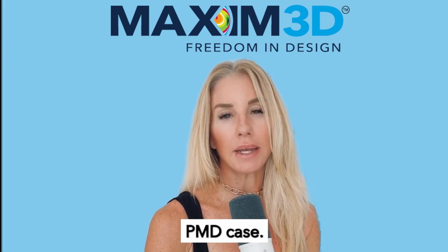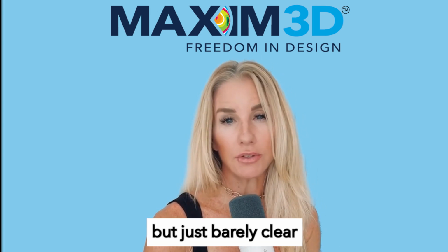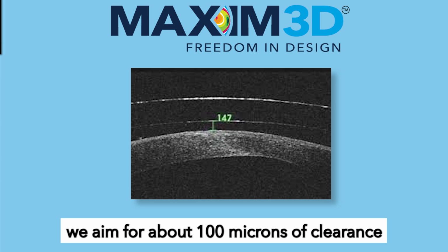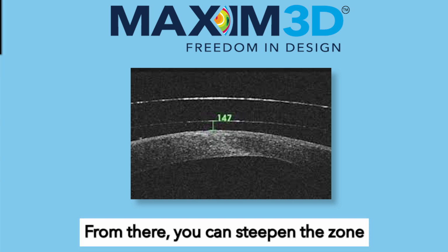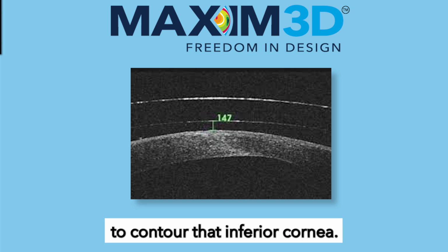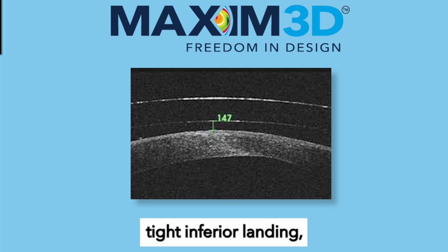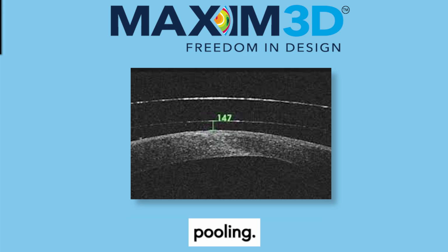Take a classic PMD case. You might see excessive vault at the top of the optic zone, but just barely clear the cornea at the bottom. Since the optic zone must remain spherical for vision quality, we aim for about 100 microns of clearance over the closest point. From there, you can steepen the zone directly below the optic to contour that inferior cornea. Then recontour outward to redistribute weight and improve the landing. This adjustment reduces tight inferior landing, improves comfort, and minimizes decentration from saline pooling.